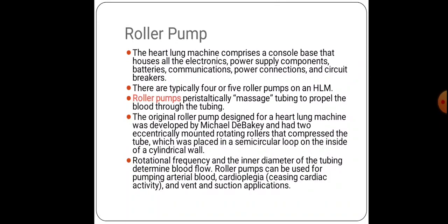So there are different types of pumps. The main types are the roller pump and the centrifugal pump. In older days, they used the roller pump. In the newer technology, they always use the centrifugal pump. So we will see why we are not using the roller pump in the newer technology.